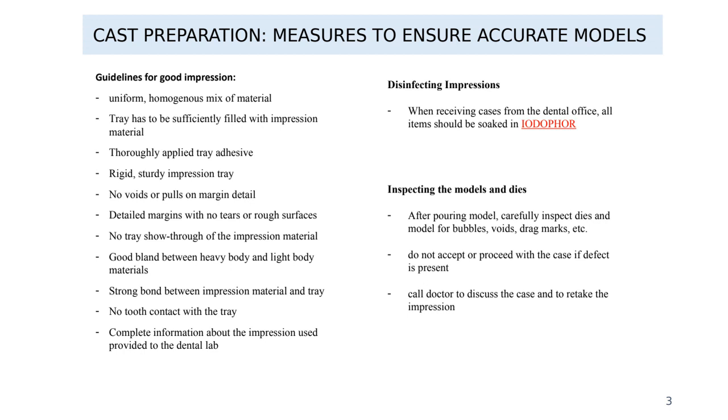The same can be said also for the digital impression, and sometimes there are certain movements when the doctor takes a digital impression with the scanner.